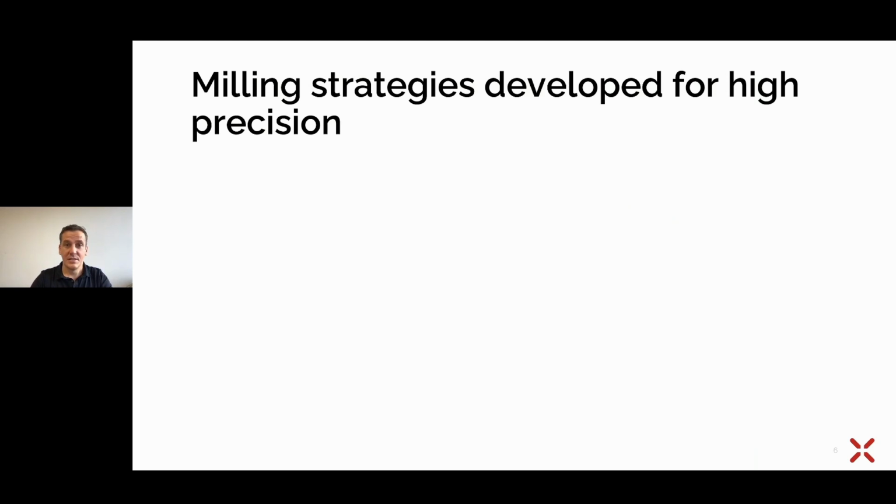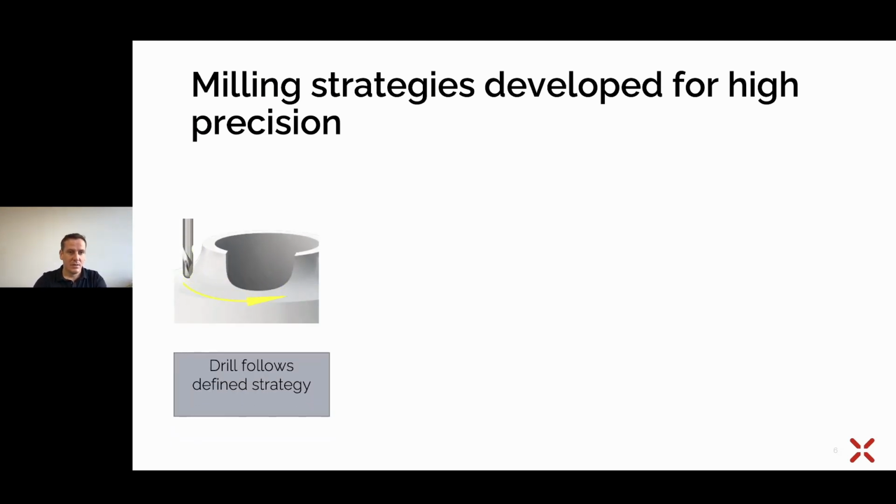Milling strategies developed for high precision. The reason why you as a milling center or a dental laboratory have to go through this class is that we need to give you the understanding of these so-called milling strategies, which you have to implement in your software later on in this training. I would like to explain the milling strategies here in a little more detail.